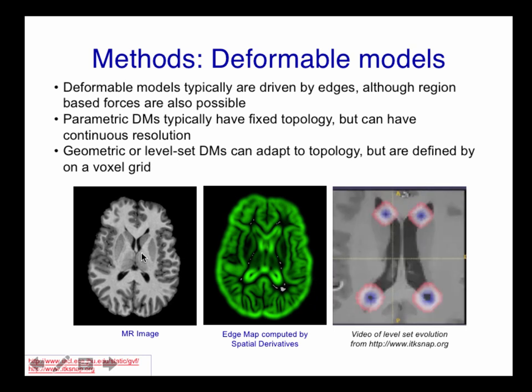So that U shape that I was showing was just showing this boundary. Typically our images don't look like boundaries, but you can actually extract boundary images from these images. Here I'm just computing an edge map based on spatial derivatives. Instead of having different regions with different intensity values, the edge map is bright where there are edges and dark where there are homogeneous regions.